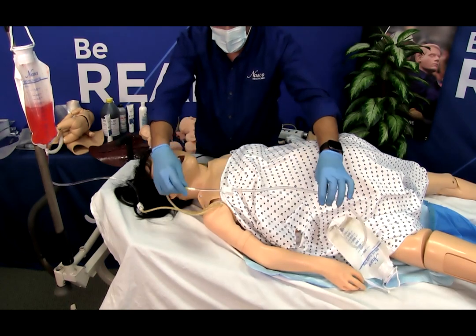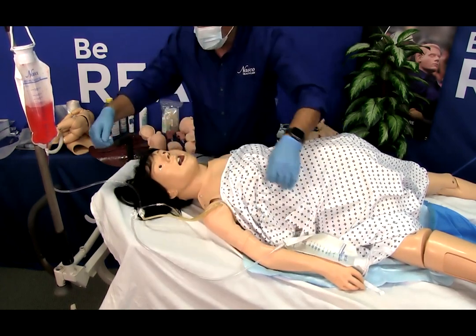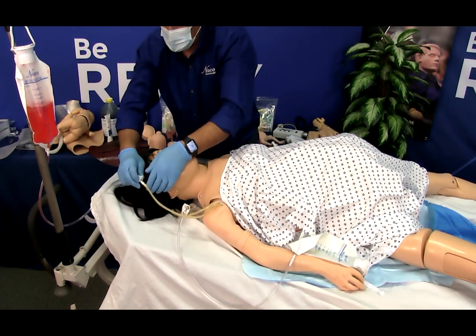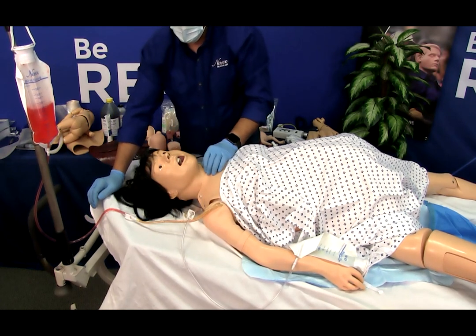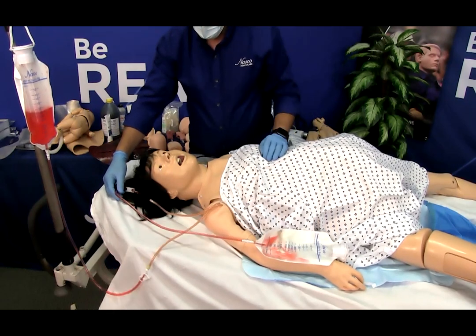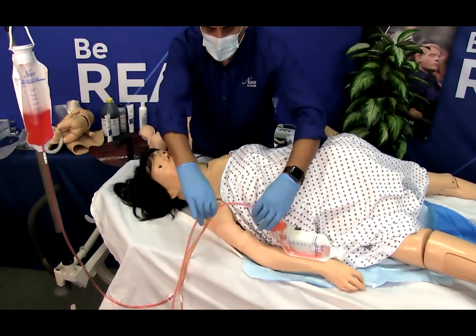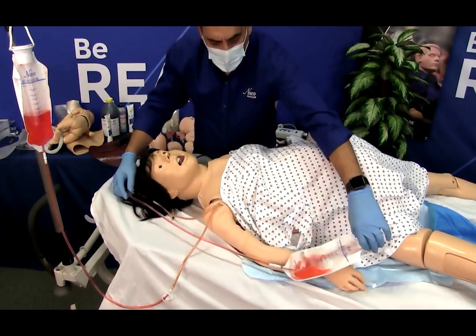To flush the vascular system with synthetic blood, slowly open clamp A on IV bag A. Allow the system to flush with synthetic blood until the air bubbles are no longer seen passing through the outlet shoulder tubing into the IV bag B. Turn the arm over to force any remaining air bubbles out of the system.